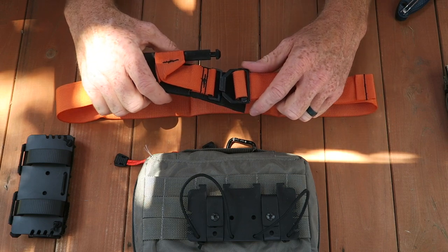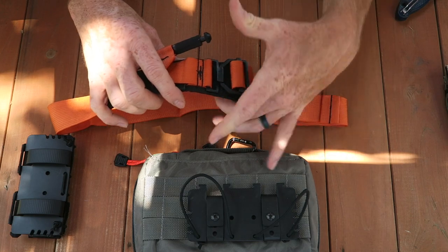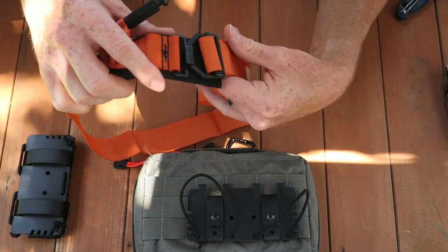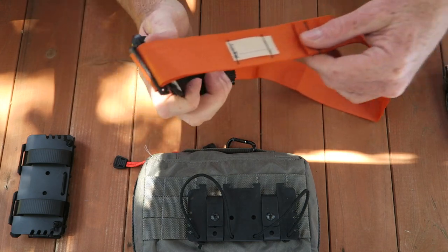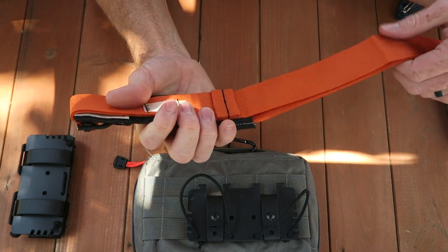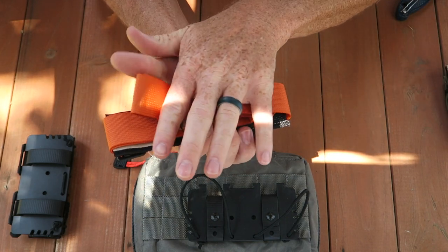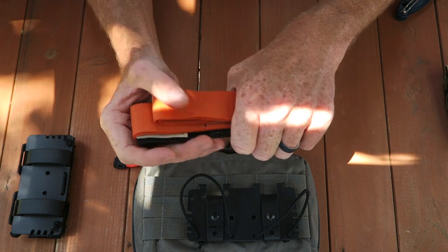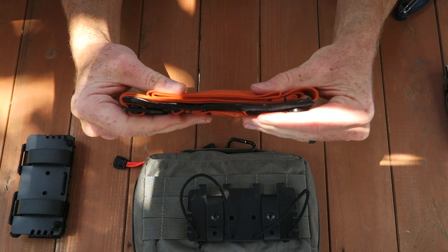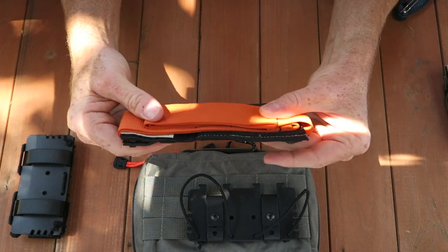Once this length is adjusted, I fold the tail and the corresponding webbing underneath the main body of the tourniquet, and then I basically do a Z fold underneath. It's as simple as that.